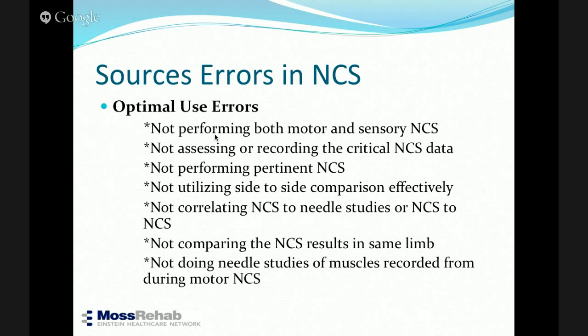So if you have normal amplitude, and the EMG you do has significant loss of motor unit potentials, you're worried whether your gain was right and whether you had appropriate recording, or were you really looking at some kind of an artifact? Or vice versa. So you have normal strength and EMG was normal and your amplitude is only 2 millivolts or 1 millivolt, where it should be 5 or 6 millivolts. So you go back and re-look at what the problem was.